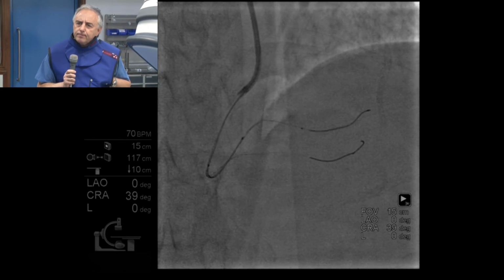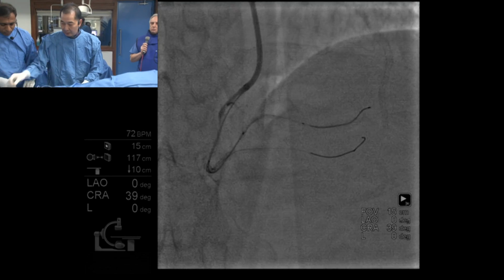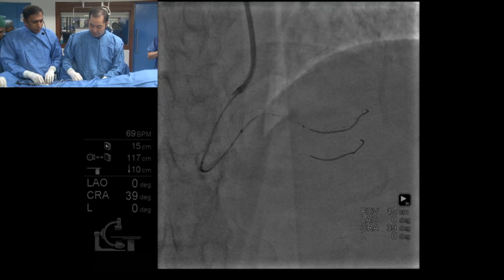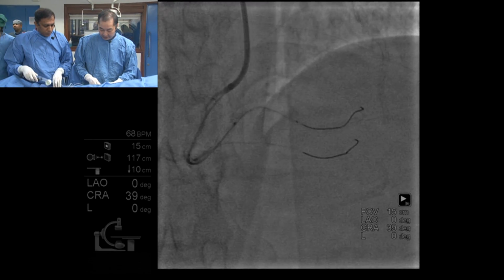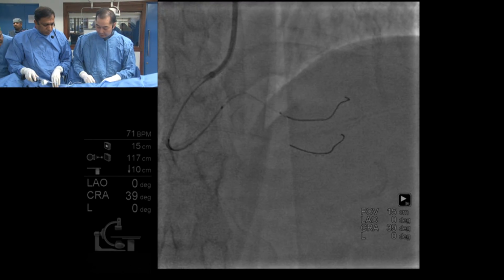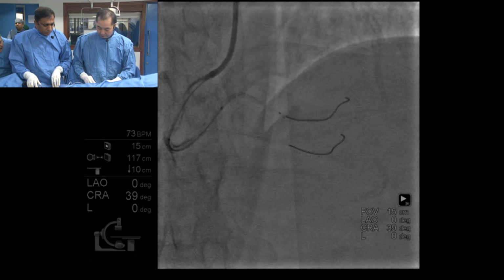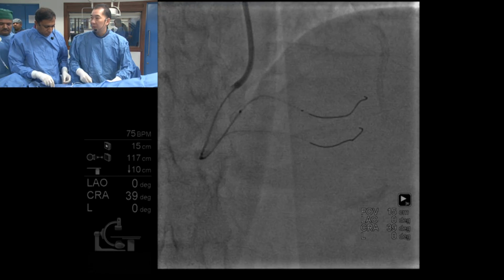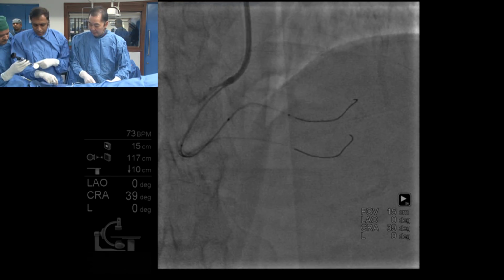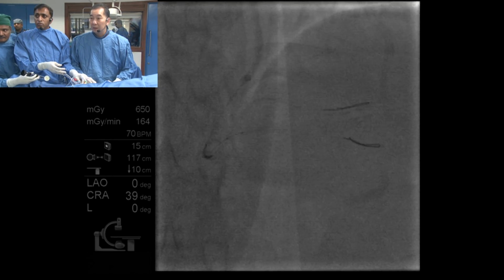Yep. I think this technique is very popular now in China and Japan, I was told, right, Dr. Akasaka? We just discussed this case before. It's very popular in Japan now. Yes. Only the wire protection might be very difficult to select after the closure or pinch. Correct. Yeah, it is important to dilate a little bit. Yes. It's quite easy to select the side branch.